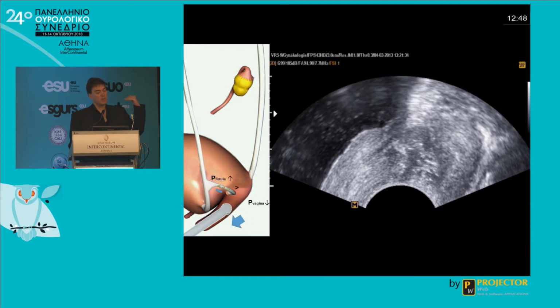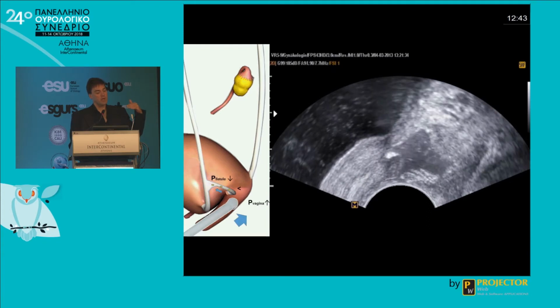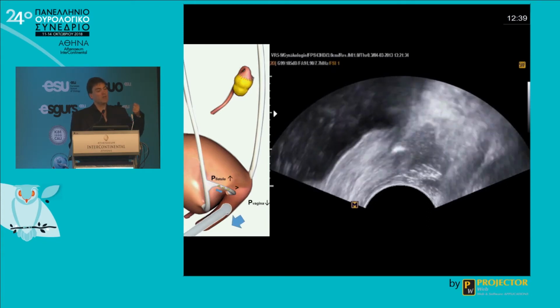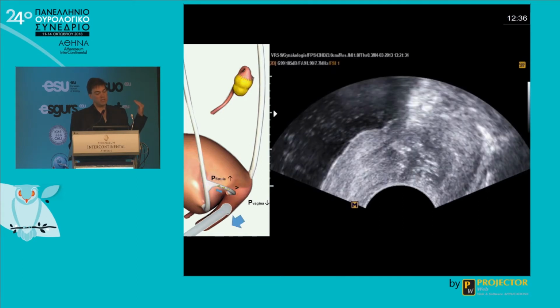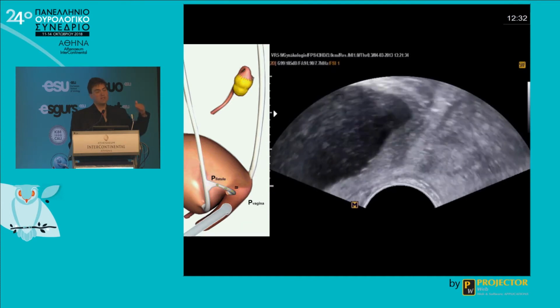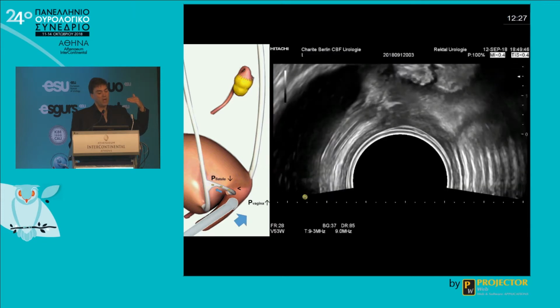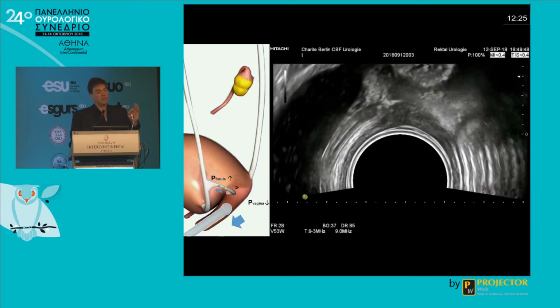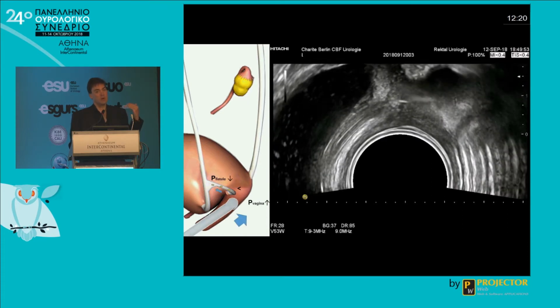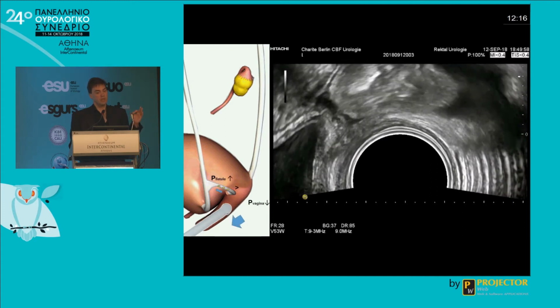Here it's also what we are interested in, the ureteric vaginal or ureteric rectal fistula. Go forward and backward. You see the ureter and you see it then. If you're moving, then the fluid comes also to your probe and you see where is the mistake. Also a nice case. That was an end-to-end anastomosis from a gynae with a PDS suture.